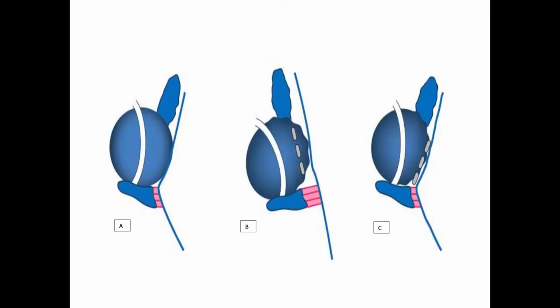This is a GU diaphragm. This muscle is the rectourethralis. That was the big find here. When you put in a probe, you straighten out the rectum. You stretch this out. You can see this on ultrasound, on sagittal. If you put in the probe and then drop the probe down, you'll just see this sort of open up, as I call it. But you put your seeds in, they look beautiful.